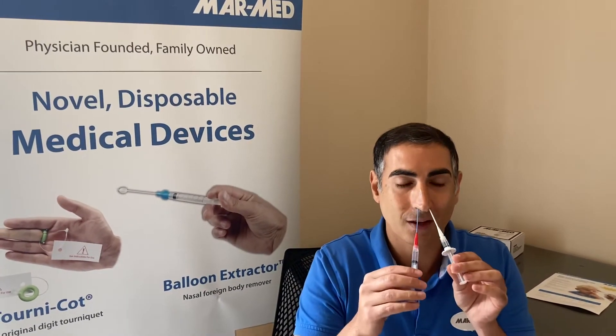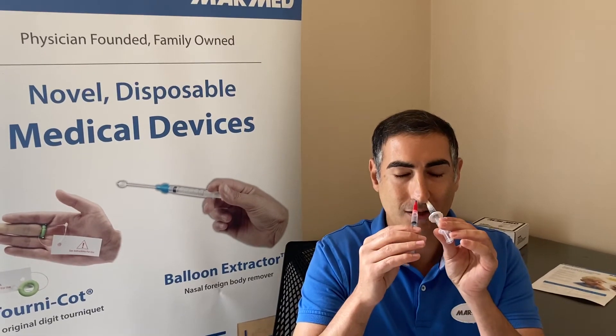To confirm, I'm going to go the extra mile here and I'm going to stick them both into my own nose. I can tell you they both kind of tickle but no rough edges or unexpected discomfort with either.